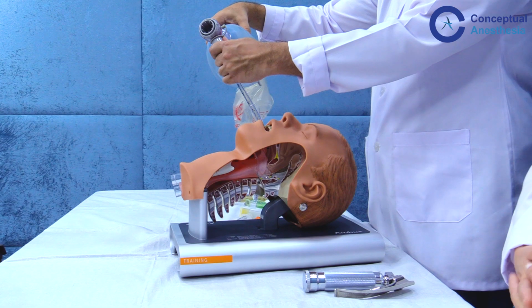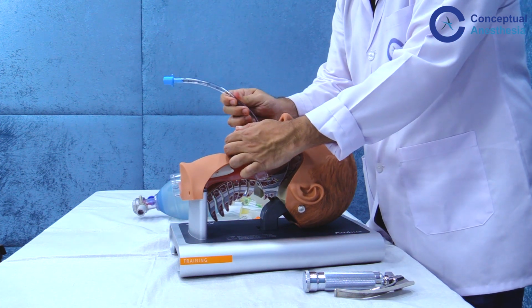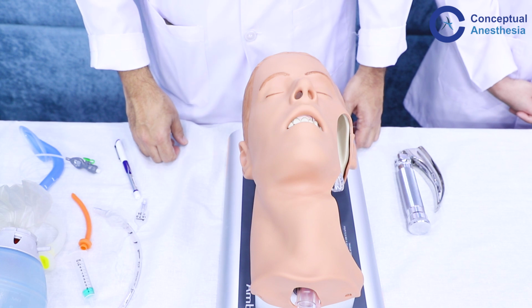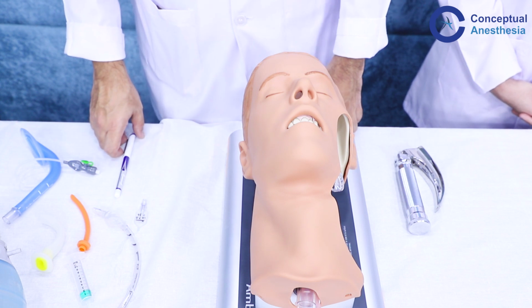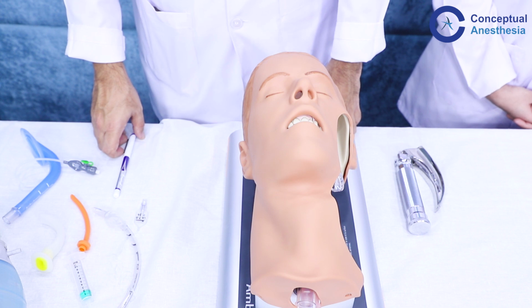Now, suppose I was not able to intubate in the first attempt, then we have a maximum of 4 attempts that we can take. In these 4 attempts, we will try to use adjuncts like stylet, bougie, different size tubes and different types of laryngoscope like McCoy or video laryngoscope. But you have to limit the number of attempts to 4.